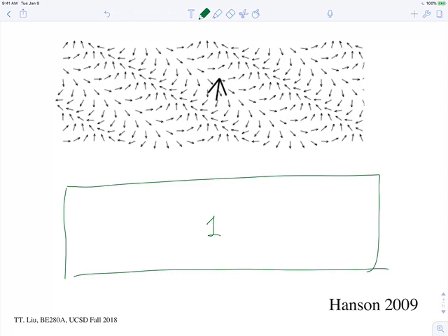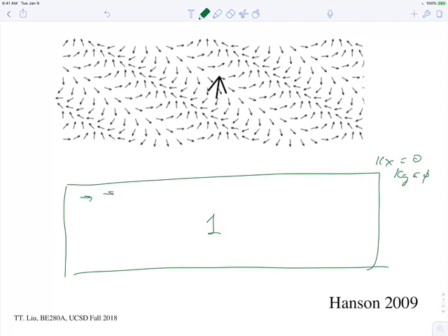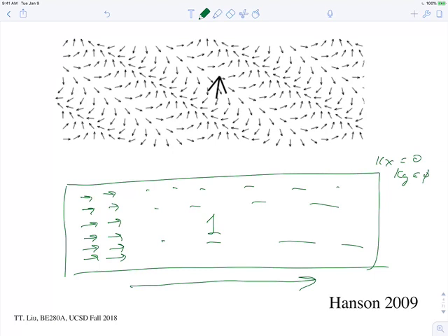Now I can imagine that at kx equals 0, let's say ky equals 0, I would have all the spins aligned. So at the center of k-space, all the spins are aligned, and since it's 1 everywhere, you just have spins of magnitude 1 everywhere. And then when I sum that up, I should get a really big value, because all the spins are pointing in the same direction. So that's telling me that if this is my object g of x, y, then g of 0, 0 would be some big number, because all the spins are aligned, so when I add them up, they give me a very big value.